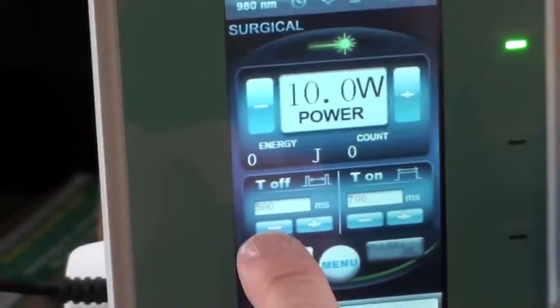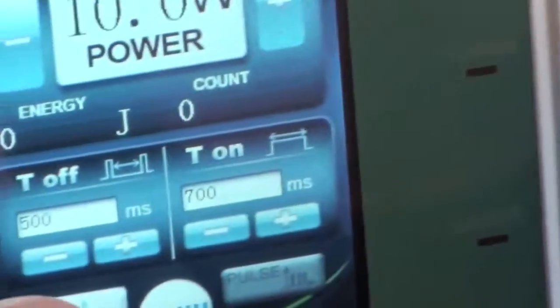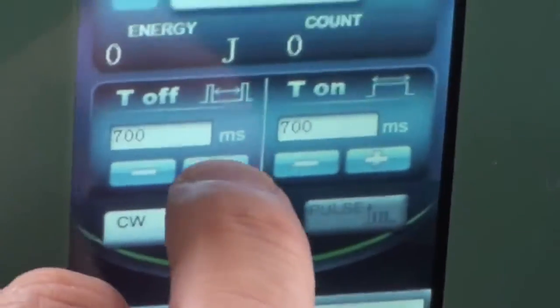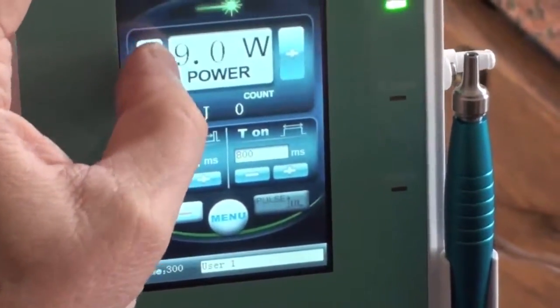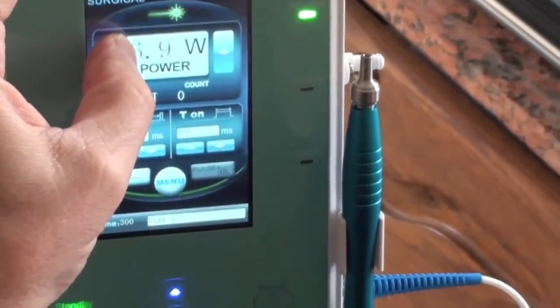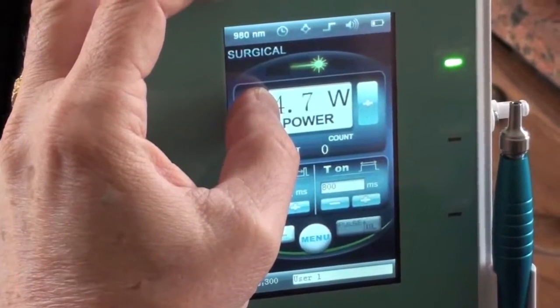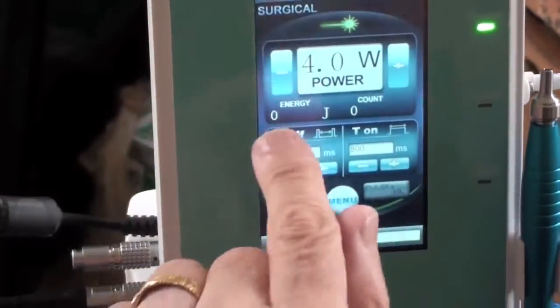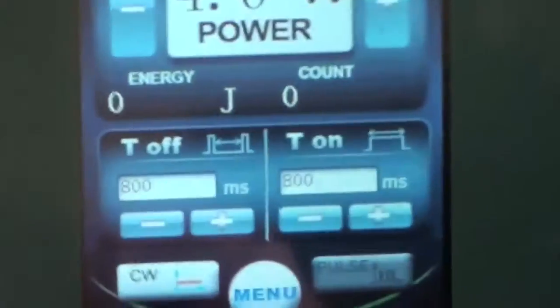And we're going to set this time on and time off. That's the pulse width. We're going to set it for 800. Here's 800. We're also going to do it anywhere from 4 to 6 watts. We're going to start at 4. You can always go up. So we have 4 watts, 800 milliseconds on, 800 milliseconds off. It's on not CW, it's got to be pulsed. If you put it on CW, it's too hot.